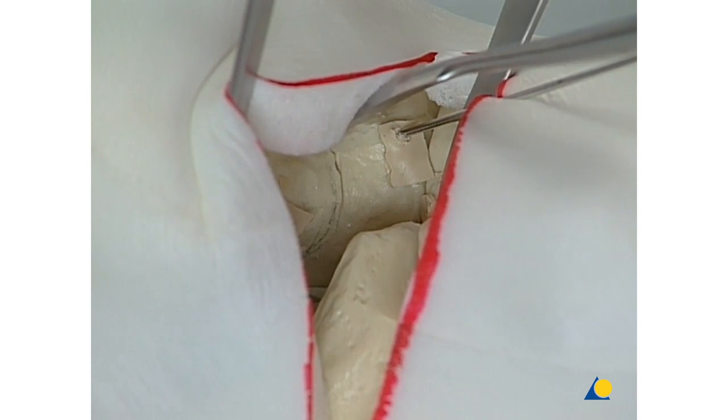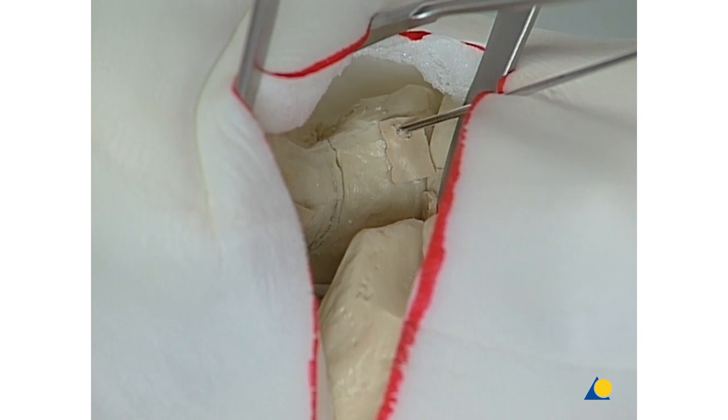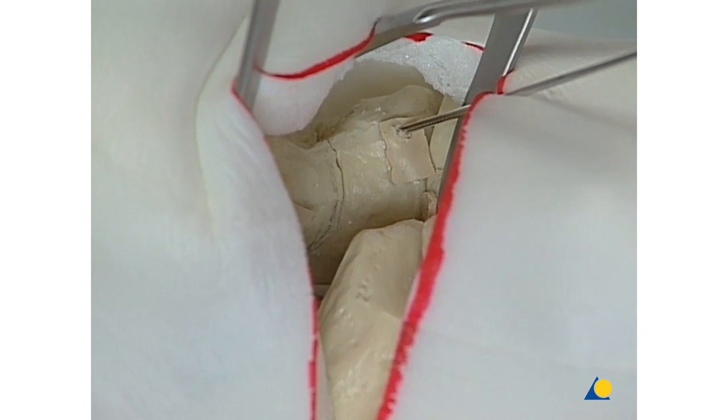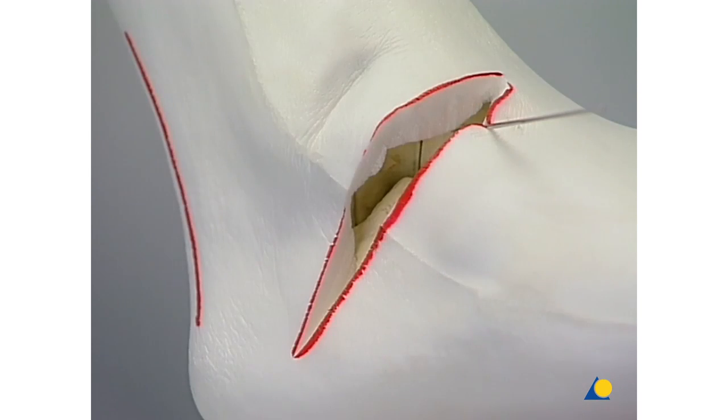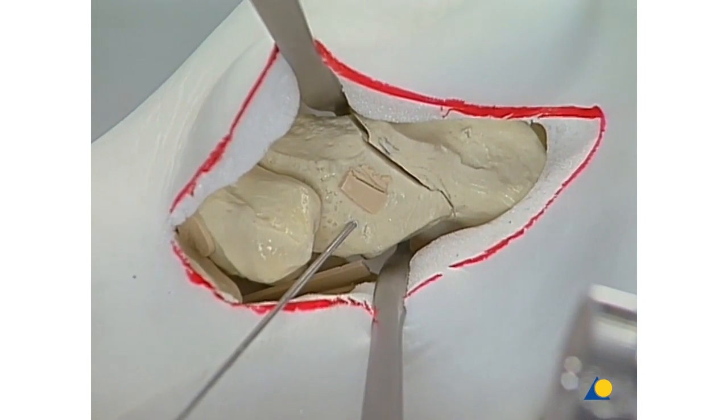Control of the reduction on the lateral aspect using the small elevator. Now we return to the medial aspect to check the reduction of the fracture.